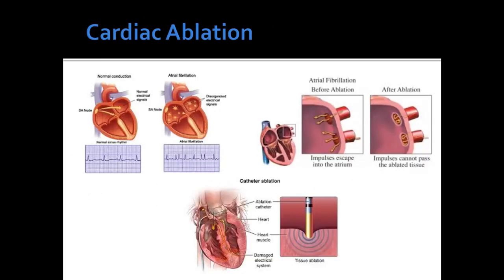Cardiac ablation is a selective destruction of diseased conductive tissue to correct atrial fibrillation. This ablation can be done with radiofrequency, RF energy, or cryoenergy. This creates scar tissue to force impulses to follow an alternate pathway to restore the normal heart rhythm. It can be performed by electrophysiologists.